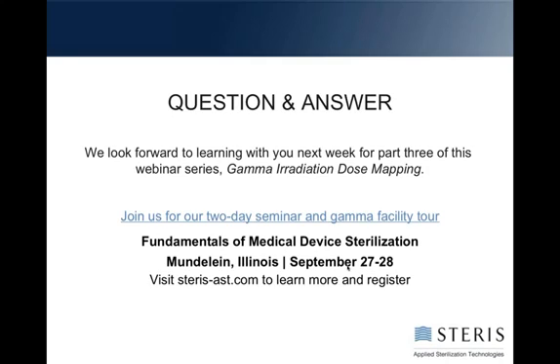Technically, no, but I would highly recommend that you do, because if you get a sterility positive, that is your weakest link. That is the thing most likely to create a problem later. It may be something that is easily identified and you can tell where it came from, and you can eliminate it from your production process. So it makes your production process more robust to know.